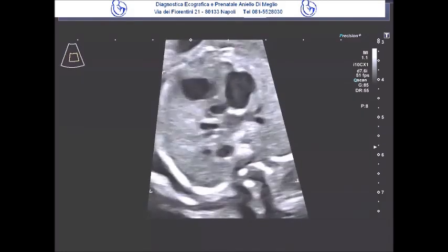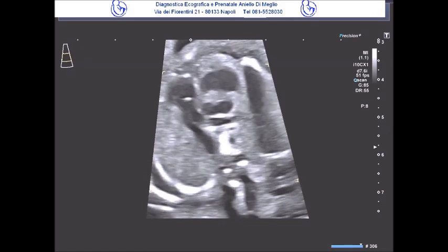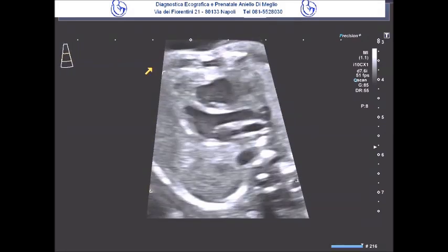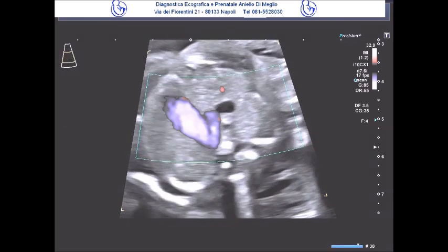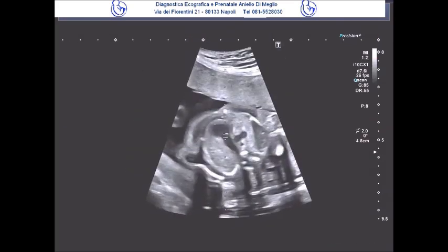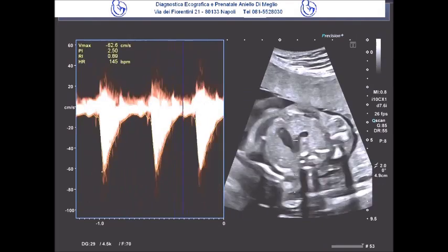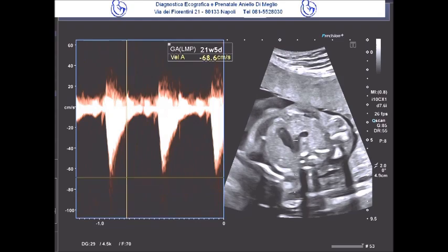Next, the left section of the aorta appears normal and regular. Then in the three-vessel trachea view, the vessels are seen to the left side of the trachea. This condition could be associated with an initial phase of cardiac overload, but there is no evidence of present heart failure, as there is no hydrops fetalis and no pericardial effusion. And we proceeded to sample. The mitral and aortic valves are both currently competent.